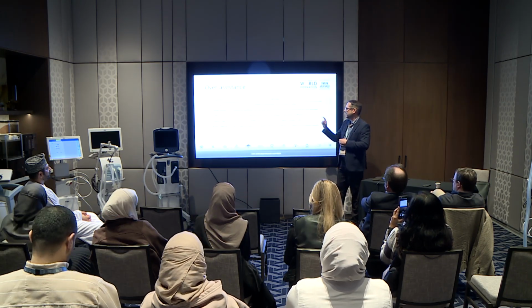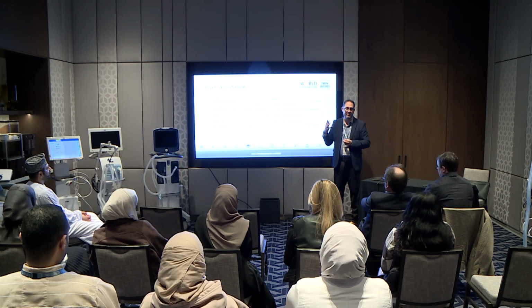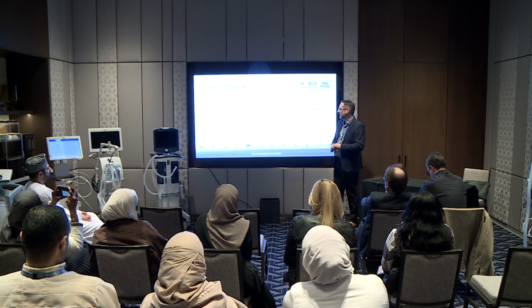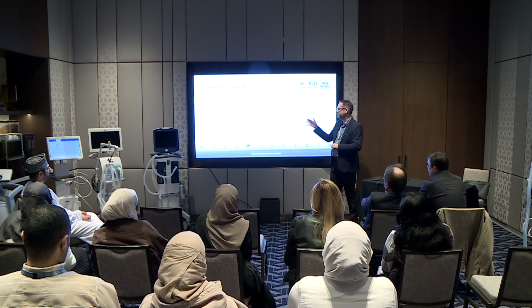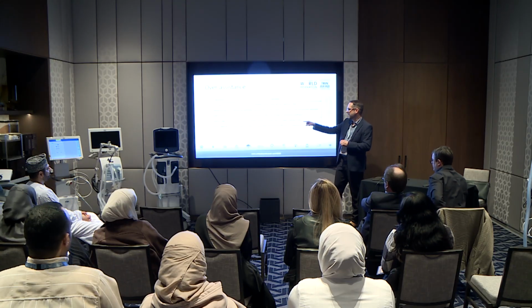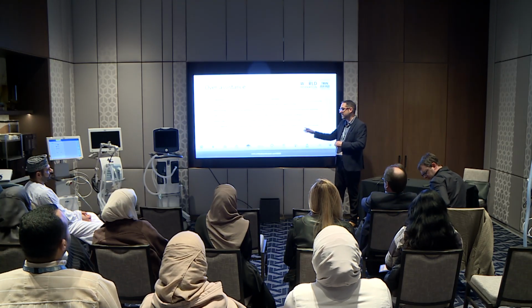Ineffective effort: the patient's inspiratory effort is not followed by mechanical insufflation, meaning they take a breath and the machine doesn't respond; they can't trigger the ventilator. Delayed trigger is a delayed response by the ventilator, so it doesn't trigger quickly enough.